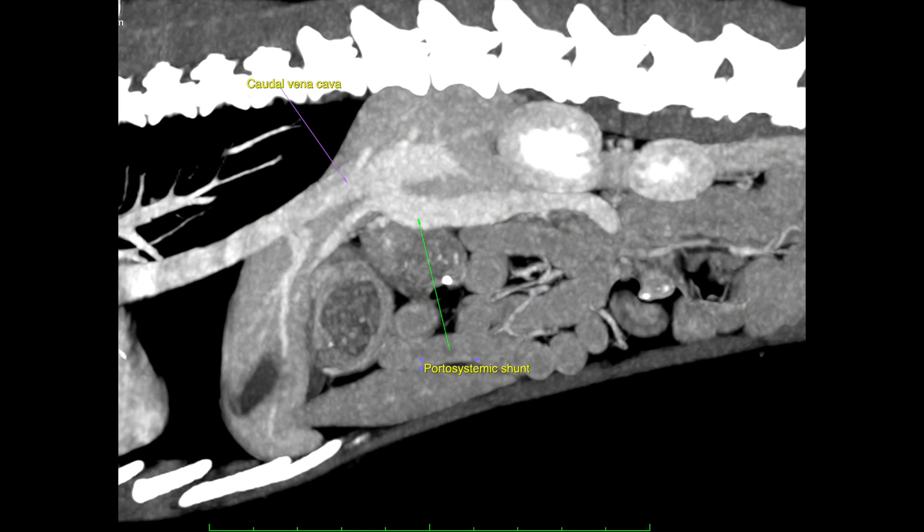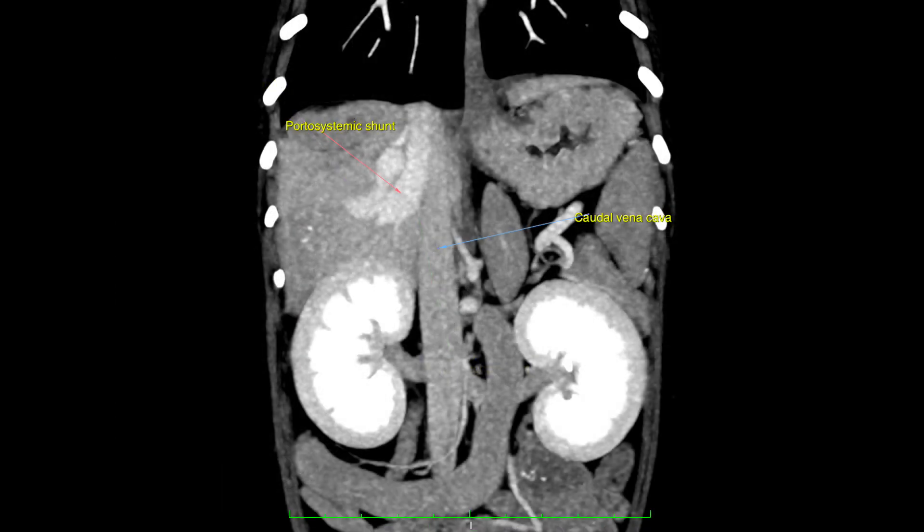Here on the sagittal view of the CT scan we can see the portosystemic shunt extending ventrally from the vena cava within the parenchyma of the liver. On the dorsal ventral view we can see the portosystemic shunt extending into the right medial liver lobe.